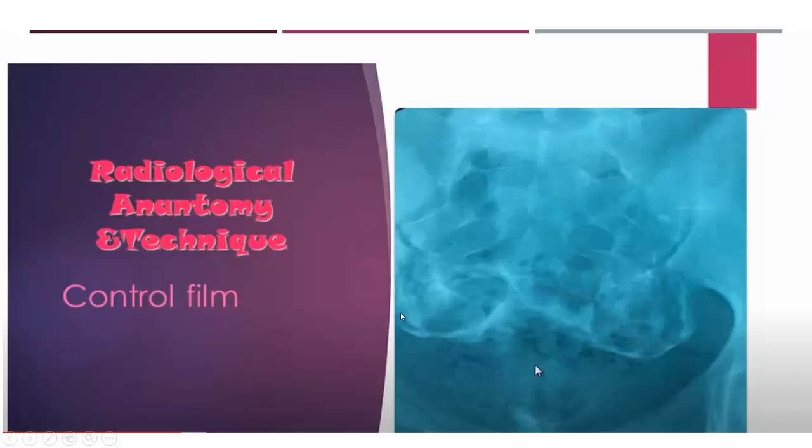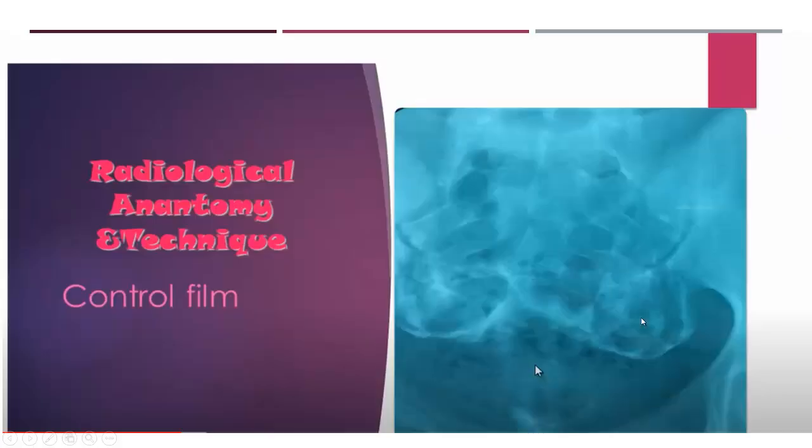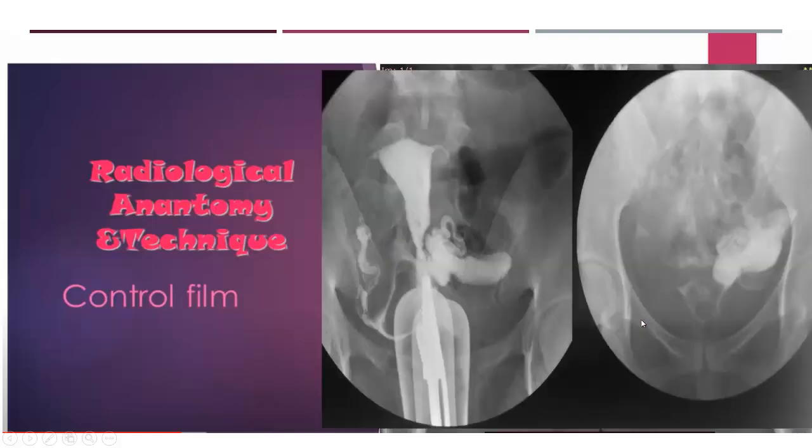We have here delineation of contrast in the, I will go through the anatomy once more, but this is one of the pitfalls. This is the normal spilling of contrast in the peritoneal folds. This is not loculation. This is just contrast in one of the peritoneal folds. So this is not loculation. And here again, this is loculation. See here, the peritoneum is distracted upwards like that. So there are adhesions here. So this is peritoneal loculation.